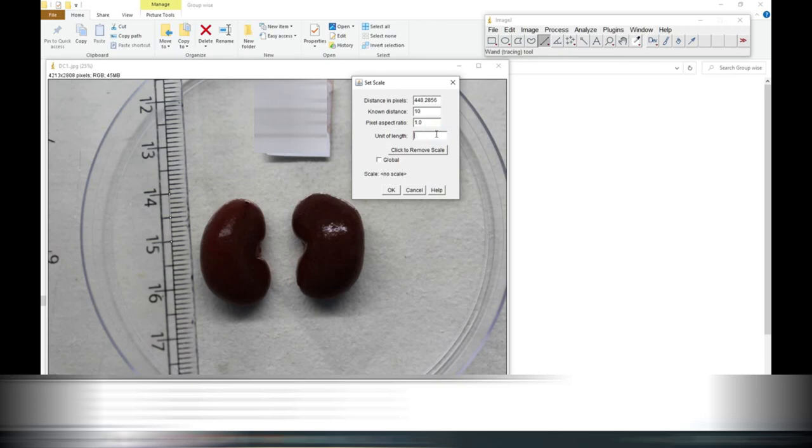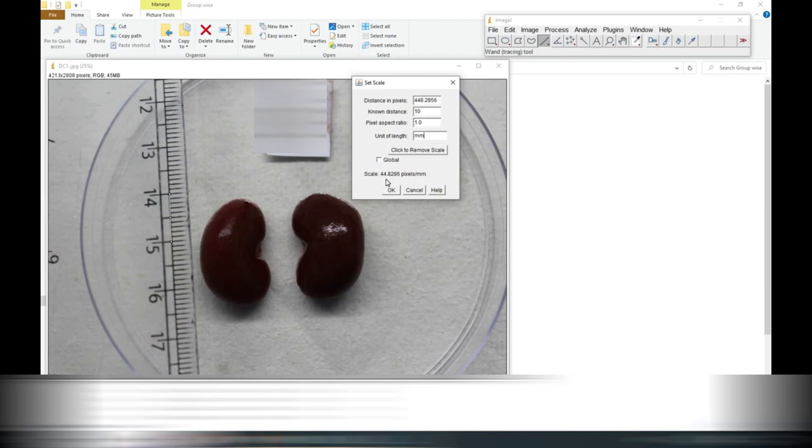Now we will select it global. While we are selecting global, then all the measurements will be set by this measurement. We will say okay and we will go ahead to measure the length.